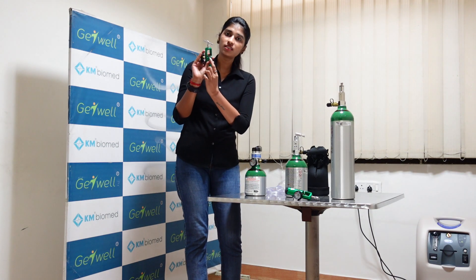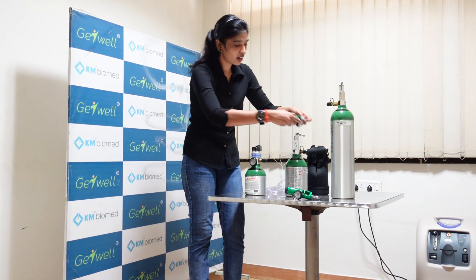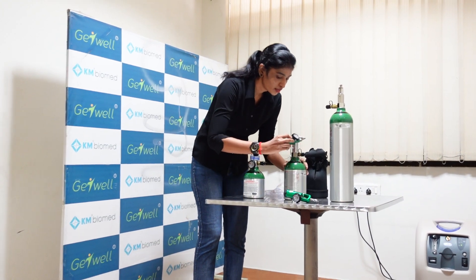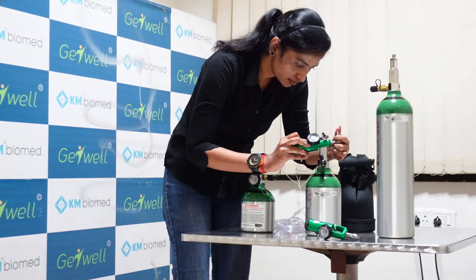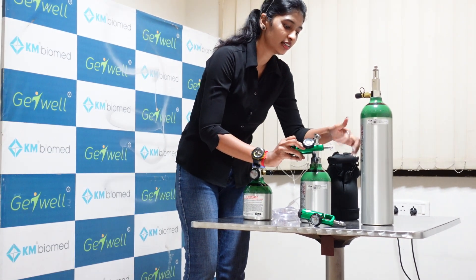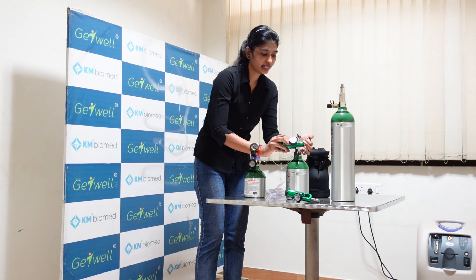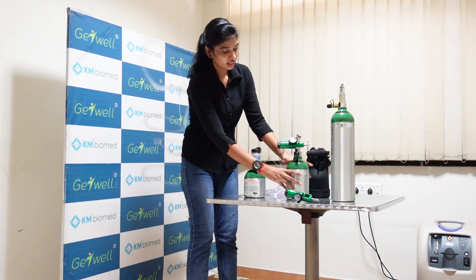I will show you how to insert this regulator into the cylinder. You can see there are two prongs on this regulator and two holes on the cylinder. You have to insert it like this and attach it exactly to that point when it gets attached. At that time you just need to tighten the lever so that it gets tightened. Simple.